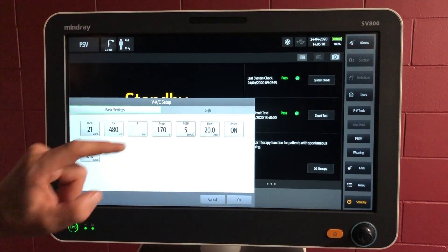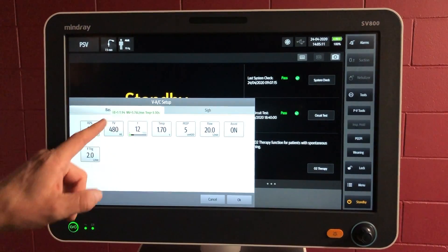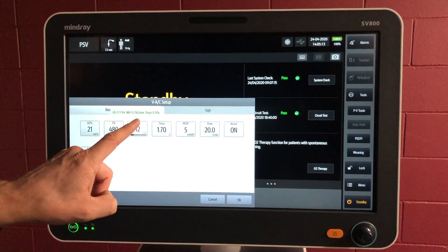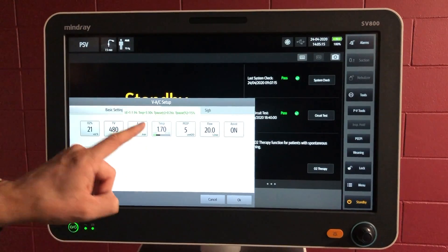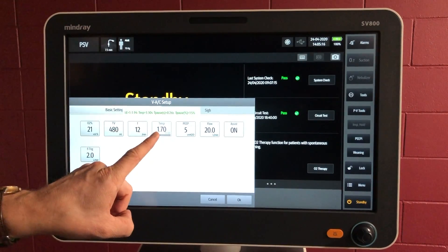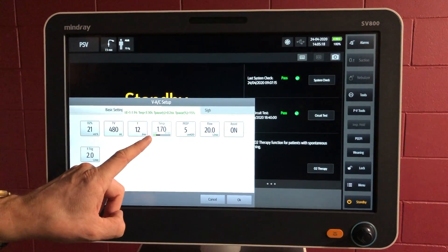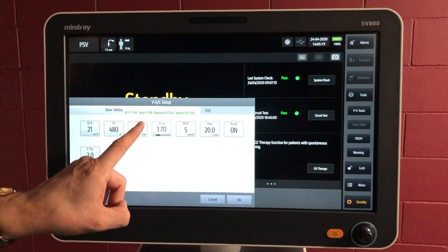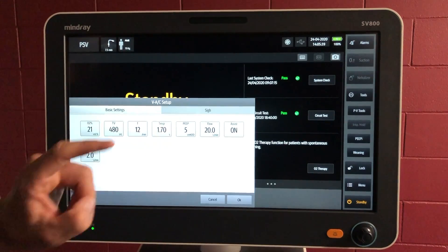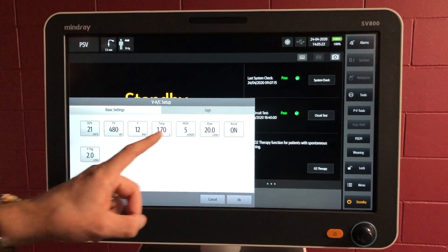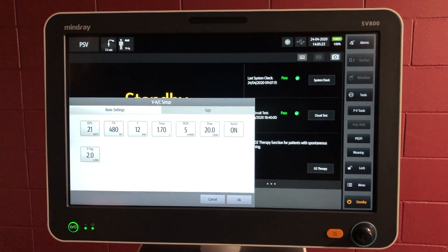Frequency — we can change that, and it'll talk about the IE ratio. If we're looking at the IE time, it'll give you the IE ratio, expiratory time, etc. So there's some extra information when you choose some of these parameters.